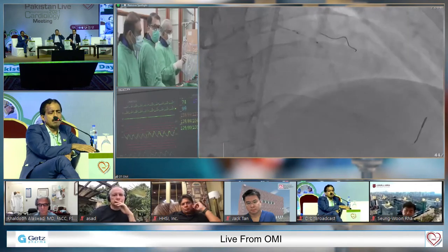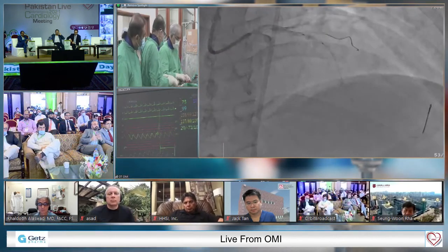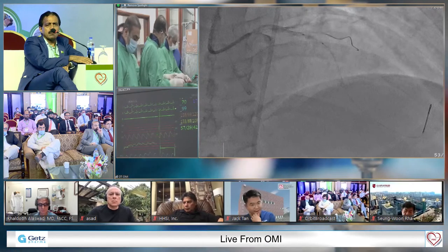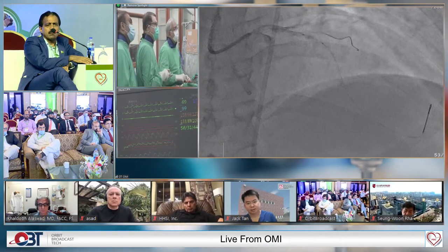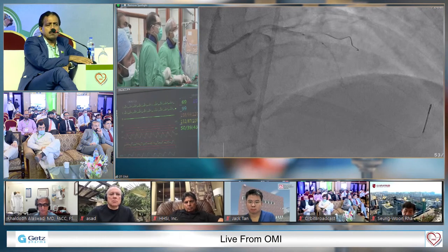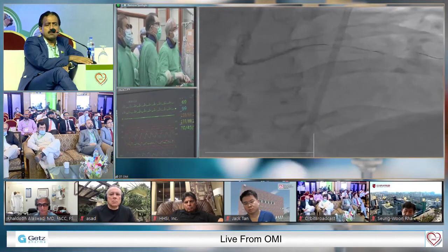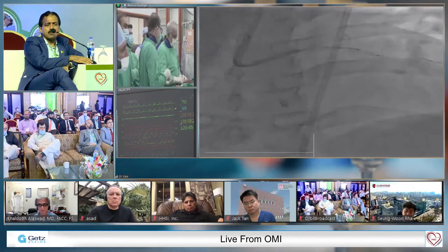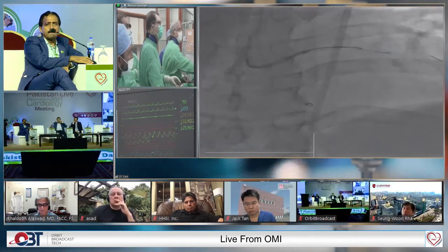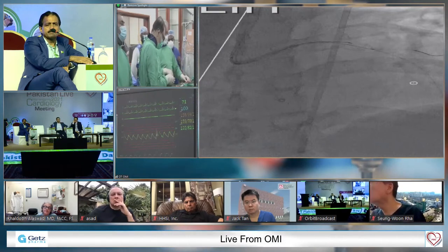Sir, a real quick comment while Dr. Sohail is working. I like the fact that there is such a nice knuckle at the end of the LAD wire, which is great, but it's also gone a long way, and because it's a big LAD. For the beginners, it's really important, and for the experienced people too, with all the manipulation that we do with the guide and balloon withdrawal and advancing, sometimes we are so focused on the disease segment that we forget to look at the tip of the wire, and you don't want to be in a situation where you have a distal wire perforation.